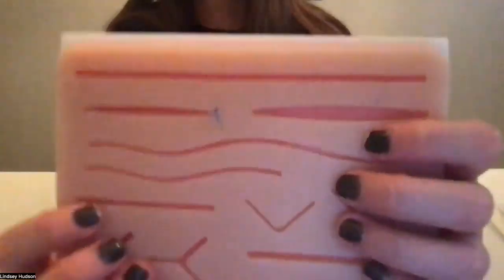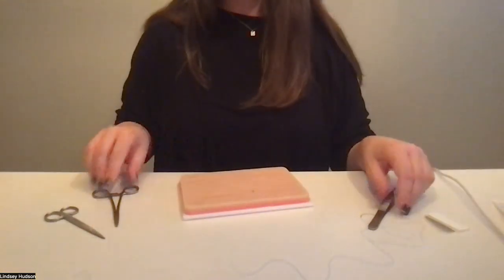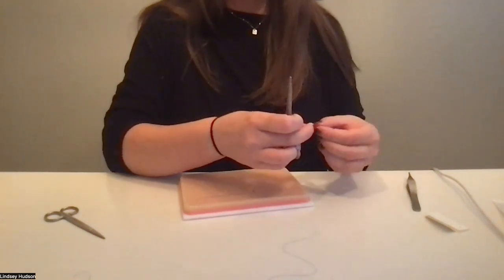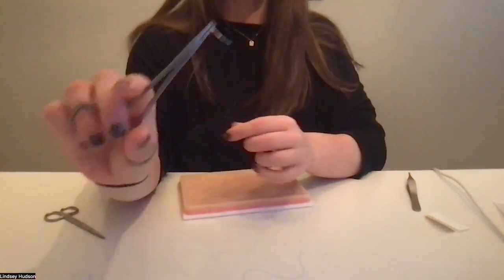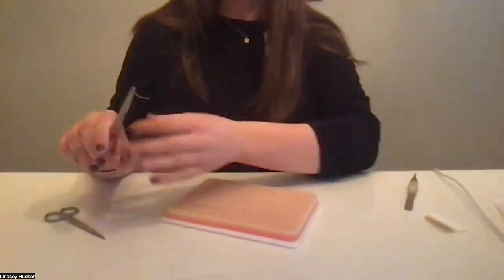So that is our first suture, and we're going to continue this 4 more times for a total of 5. So again, you're going to take your needle driver, grab your needle and clip it into the back like so. And now you're going to go about 10 millimeters away from that first suture.